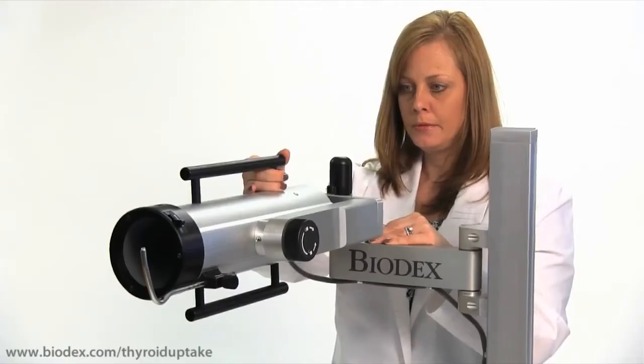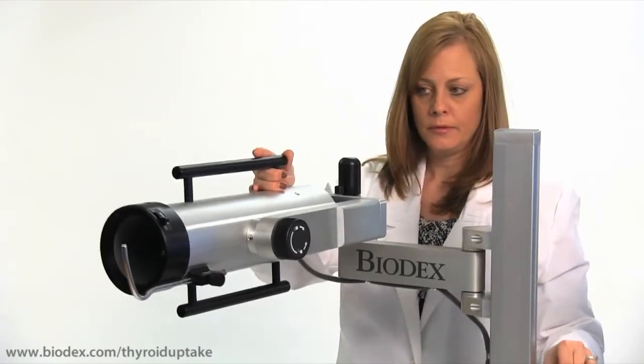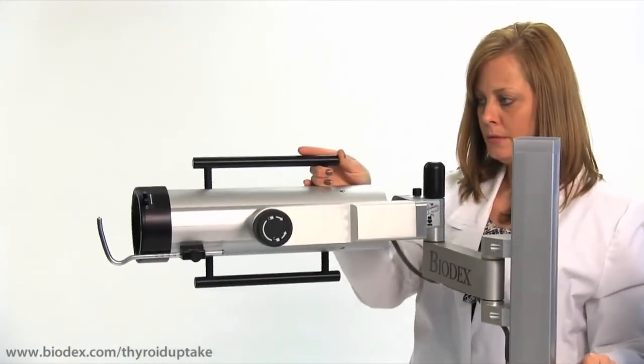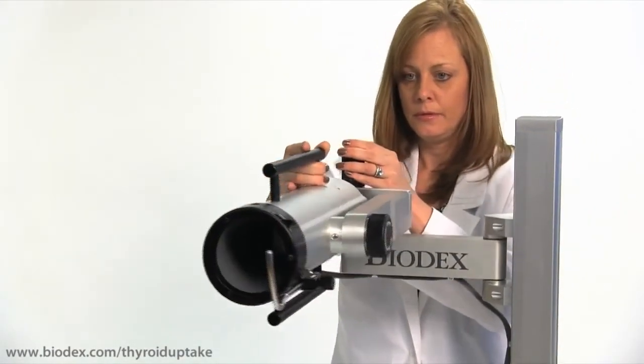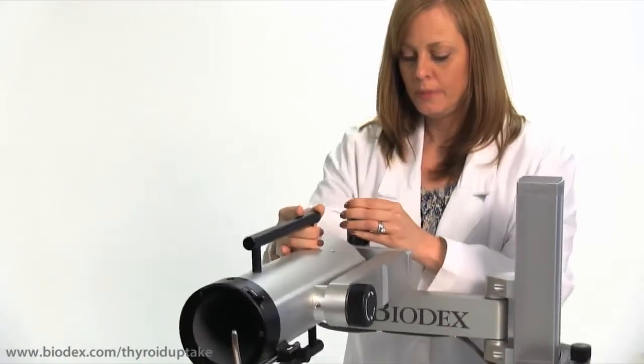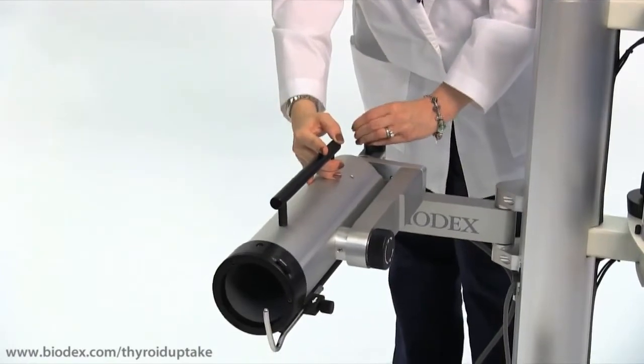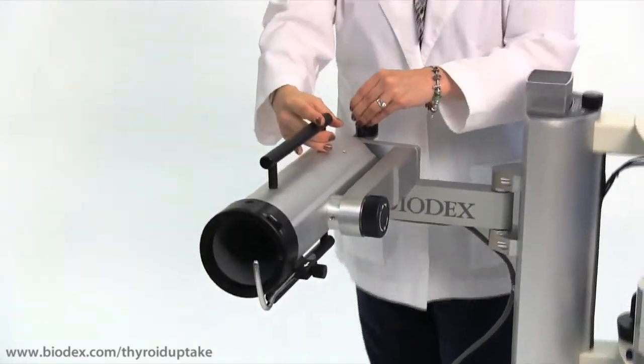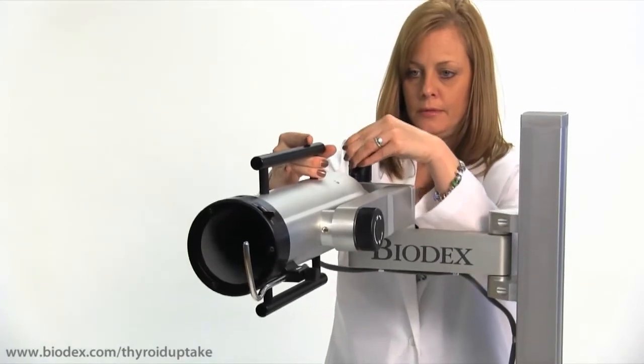A 2x2 sodium iodide detector with collimator shield articulates on a multi-axis and height-adjustable counterbalanced arm. The 24.5 inches of vertical travel allows the probe to be positioned from 30.5 to 55 inches in the horizontal position from the floor to accommodate seated or supine patients.